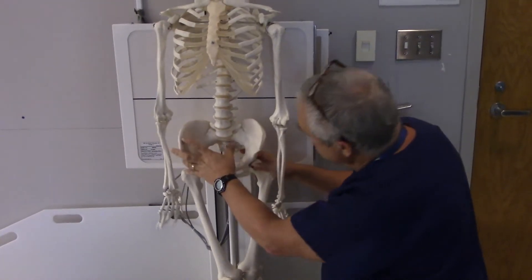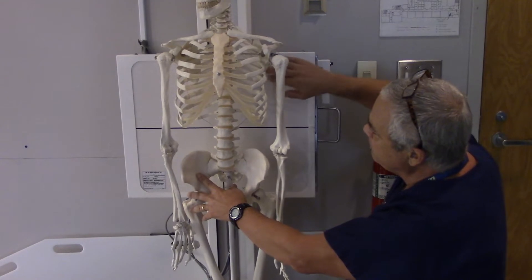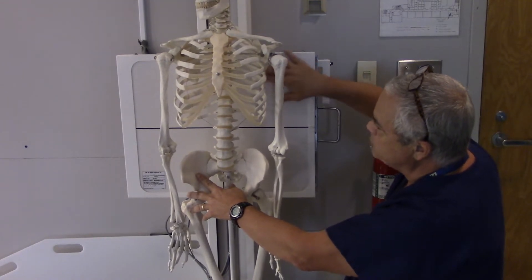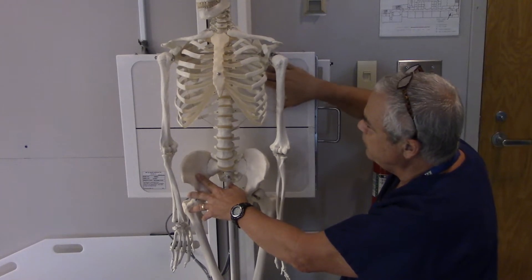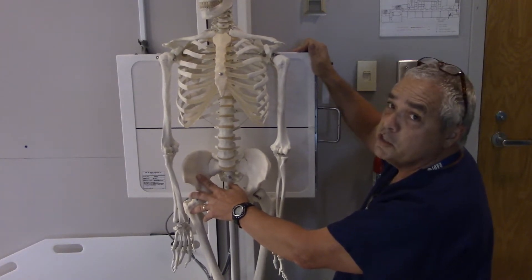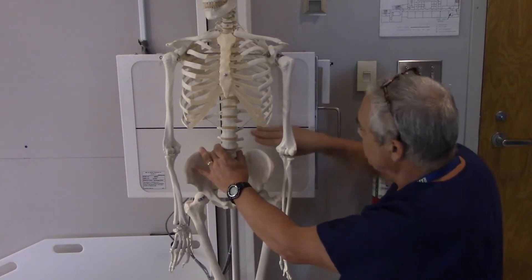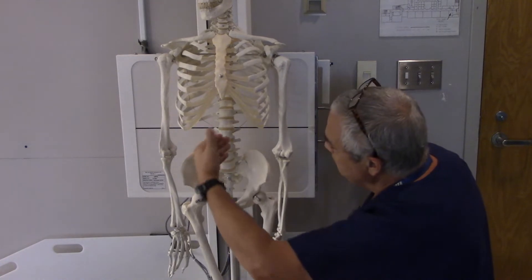I've got my film in lengthwise and I'm going to put a left marker down low. I don't want to put my marker close to the top because it could obscure the diaphragm. We don't want to block out any of the diaphragm because that's one of the primary things the radiologist needs to see. So three fingers above the crest, then bring the central ray in aimed at the midline.